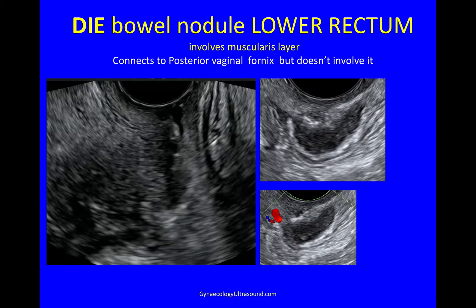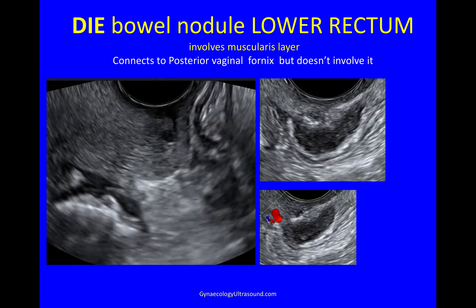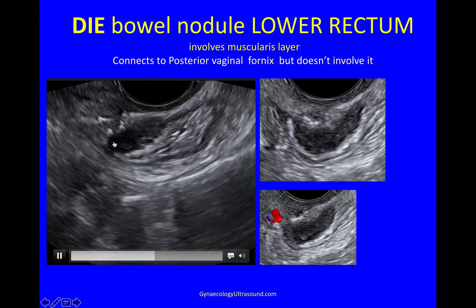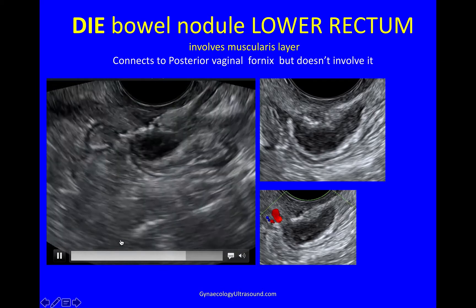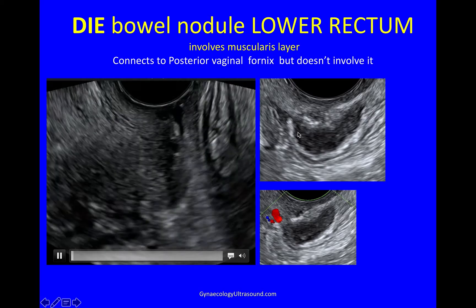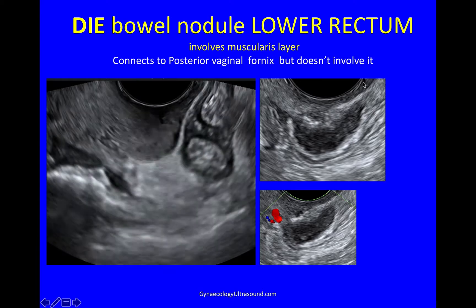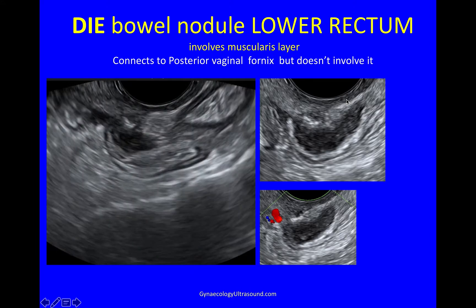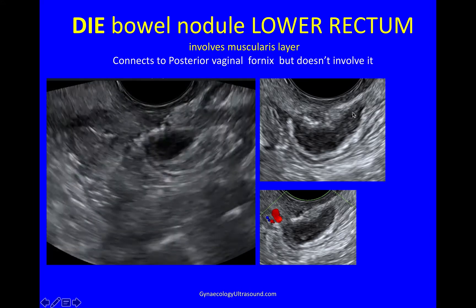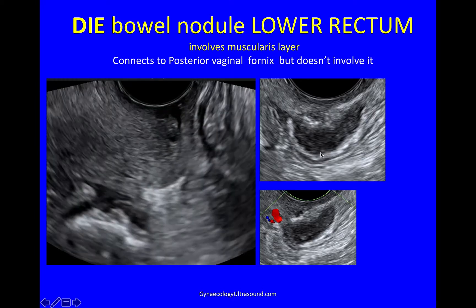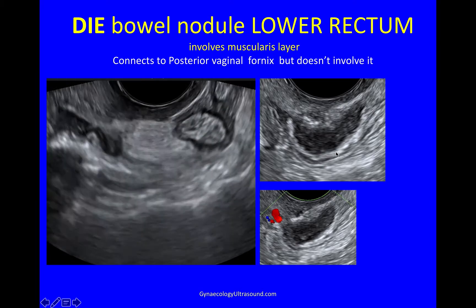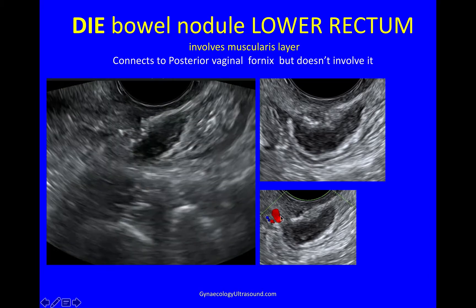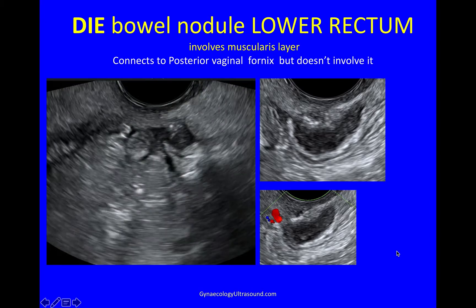Here you will see a nodule of DIE in the lower rectum. There's the probe going into the posterior fornix — that's the posterior vaginal wall. A bit of fibrosis there, and here is a nodule in the lower rectum. It's connected to the posterior vaginal fornix but not involving it, because you can see the posterior vaginal fornix itself is very white, dark and thin — not thickened and not involved. Here you can see the bowel nodule and the muscularis layer. Overlying it is the submucosa, which is white and looks quite regular, so it's probably not involved. This is the muscularis layer of the posterior wall. When you put colour on, you can see this nodule does not have much vascularity, so it's not suspicious.